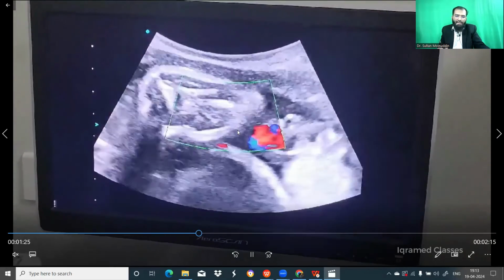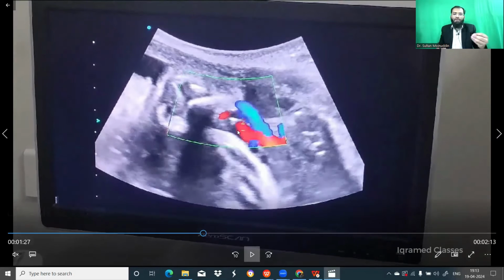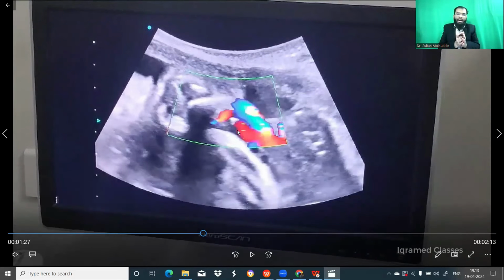Now look here at this. This is the part which I was talking about. So till now, the fetal part was freely moved. The fetal cord was free. The part which we were examining was not covered by the fetal part. It was a free loop of cord.